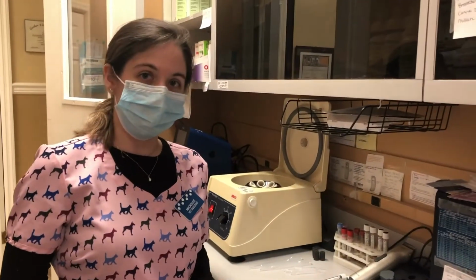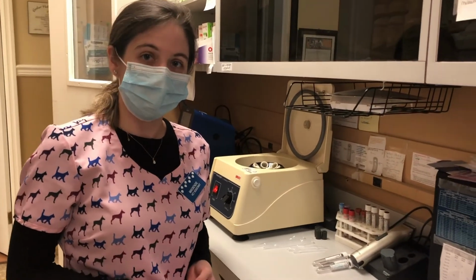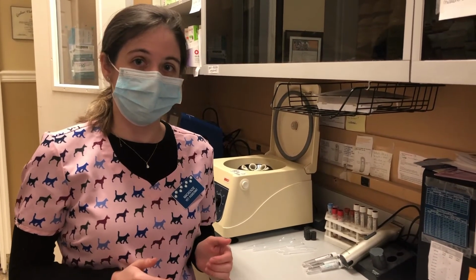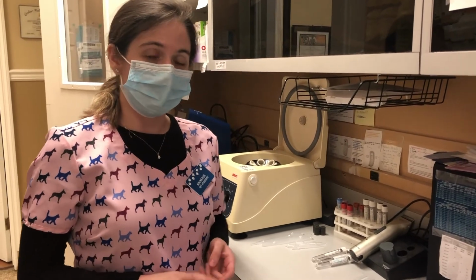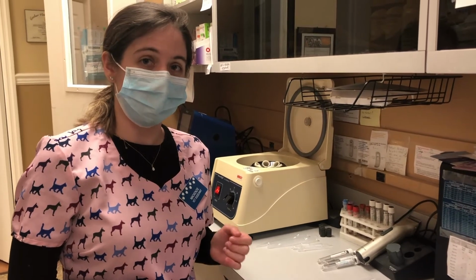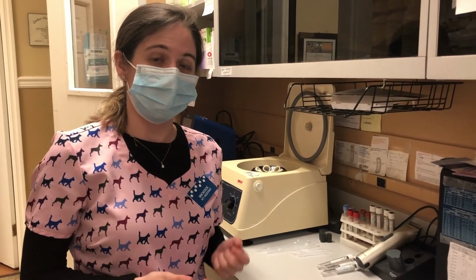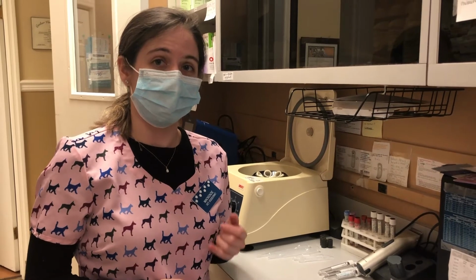Now that we've finished putting together our cell suspensions for our donor and our recipient, we can start to do our testing. Cross-matching actually has 2 parts to its test: the major cross-match and the minor cross-match. The major cross-match tests the compatibility of the recipient serum to the donor red blood cells. And the minor cross-match does the exact opposite. It tests the donor serum to the recipient red blood cells.